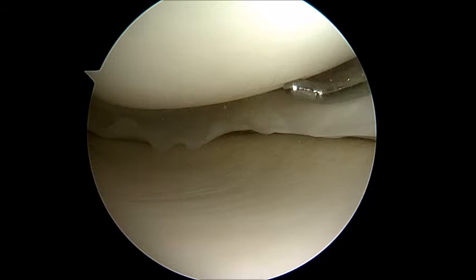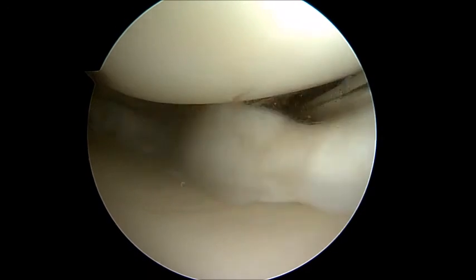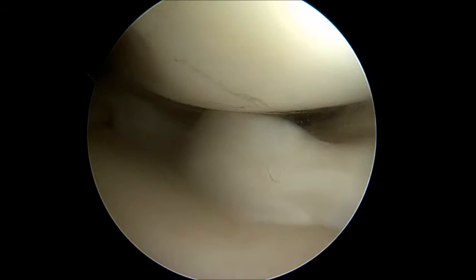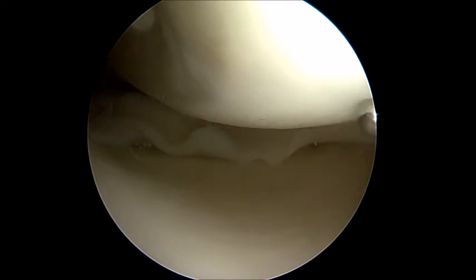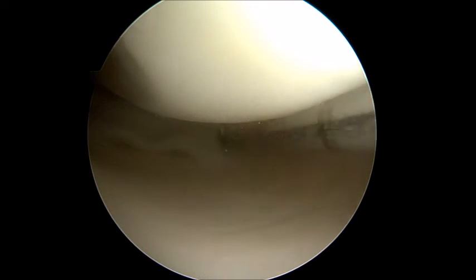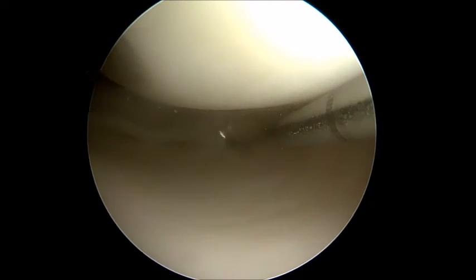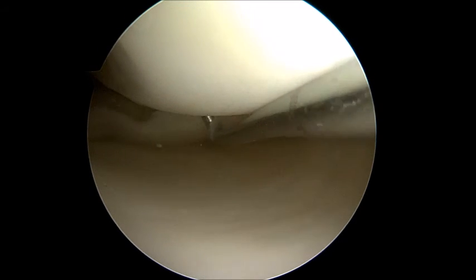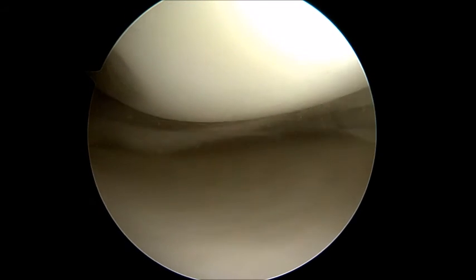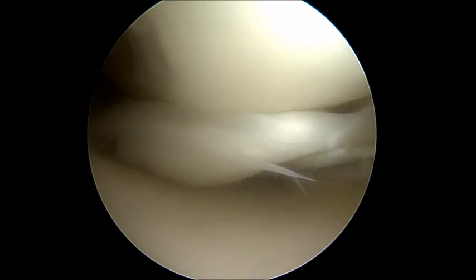A probe is then inserted to assess the stability of this tear. You can see how easy it is to displace this flap of meniscus tissue into the joint. When the meniscus moves in this manner, it will cause symptoms such as locking and catching, which were experienced by this patient prior to surgery.